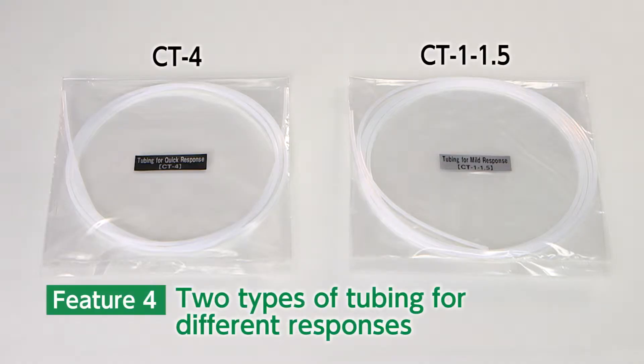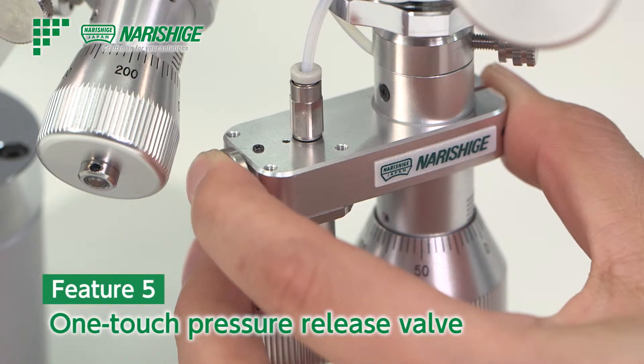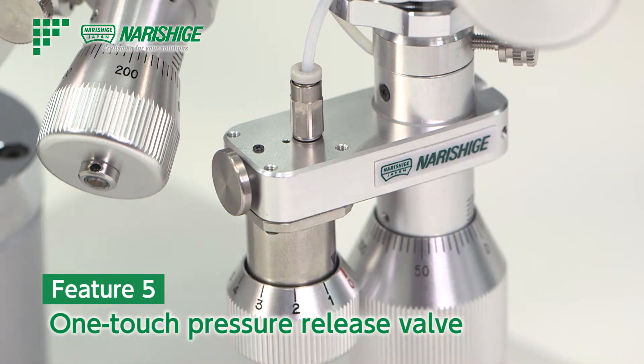Response speed can be adjusted by changing the tubing. There are two different sizes of tubings included as accessories. Despite its compact body, the one-touch pressure relief valve is also equipped.